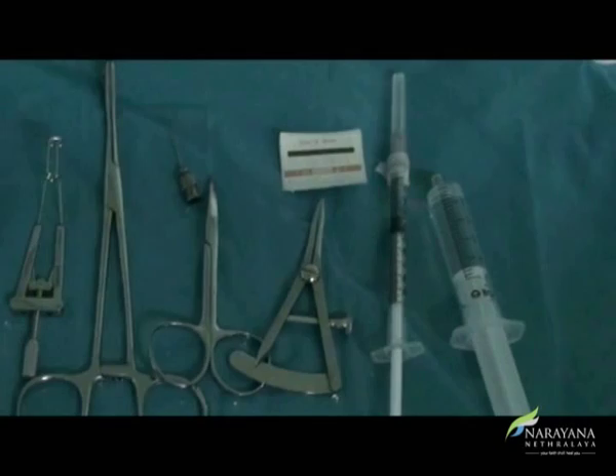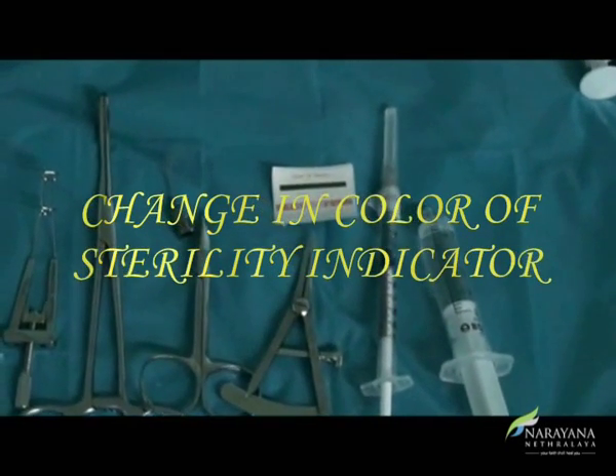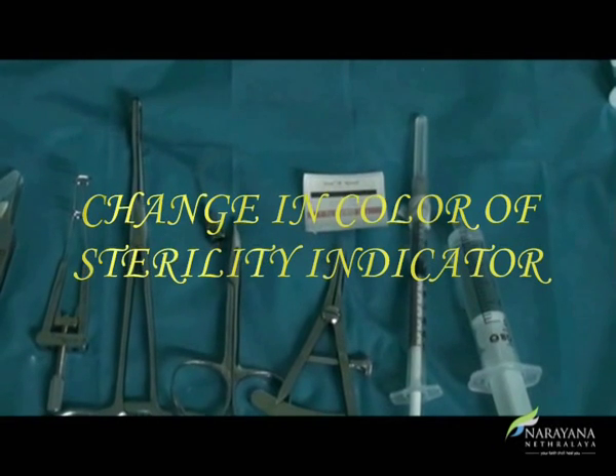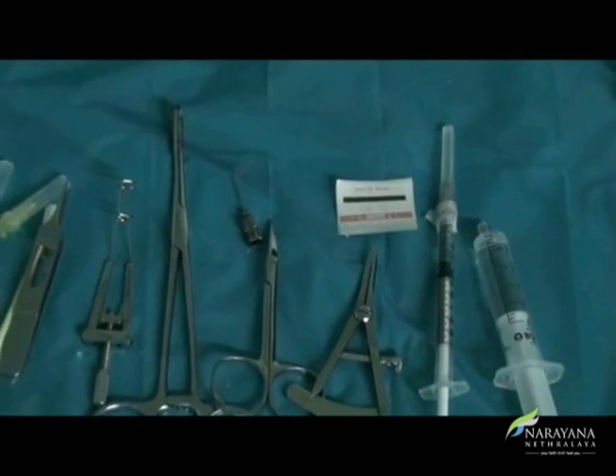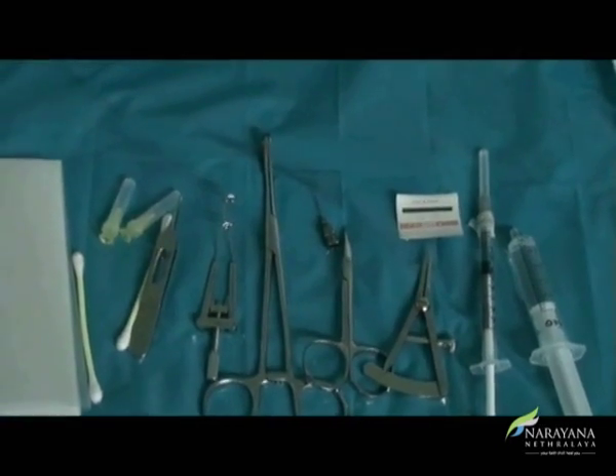The injection trolley should be ready with a sterile painting and draping set, a speculum, sterile cotton buds, a syringe of saline, a pre-loaded 1cc drug syringe, 30-gauge needles, and a caliper.